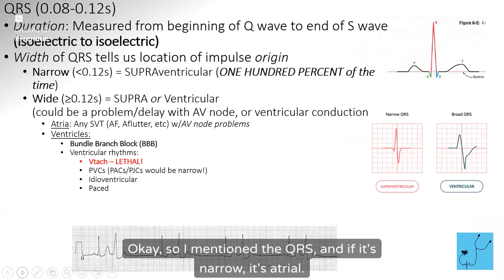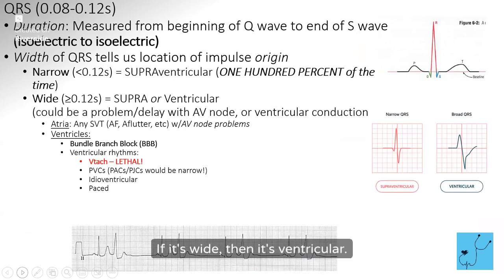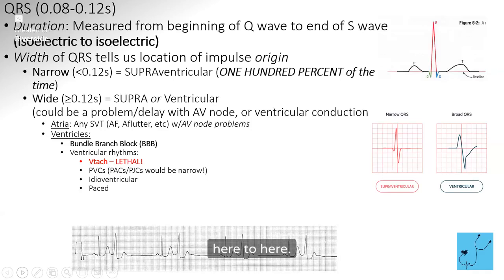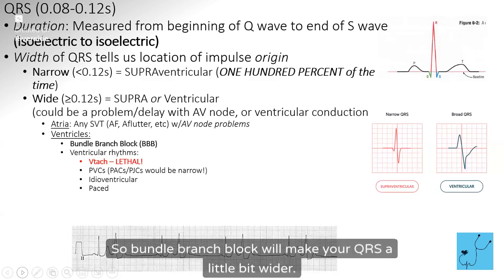Okay, so I mentioned the QRS, and if it's narrow, it's atrial. If it's wide, then it's ventricular. So this shows you a narrow one. So you're measuring from here to here when it comes back to the isoelectric line, and then here to here. It's pretty wide. Okay. So bundle branch block will make your QRS a little bit wider.